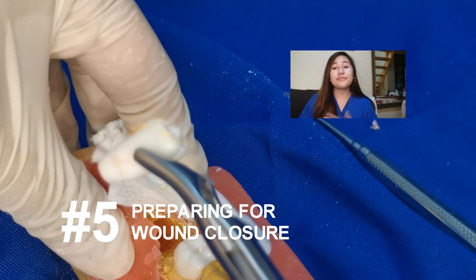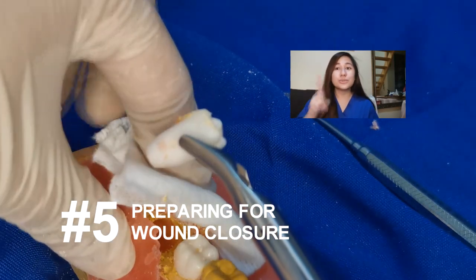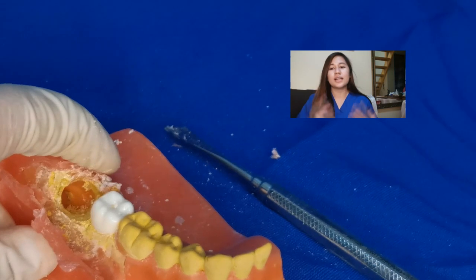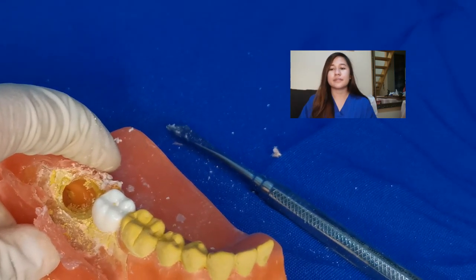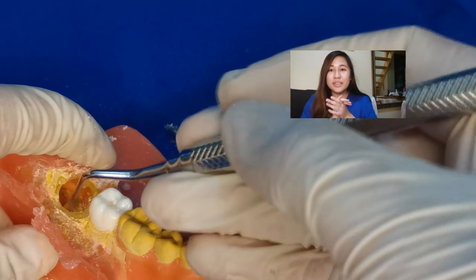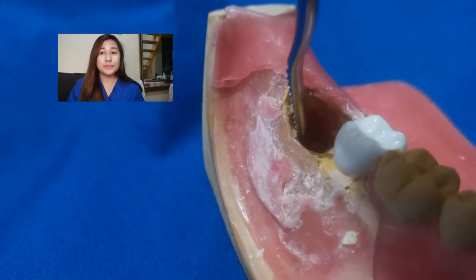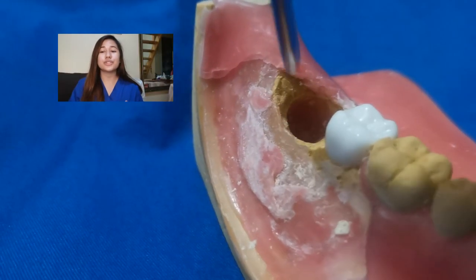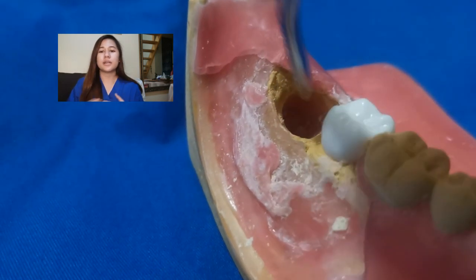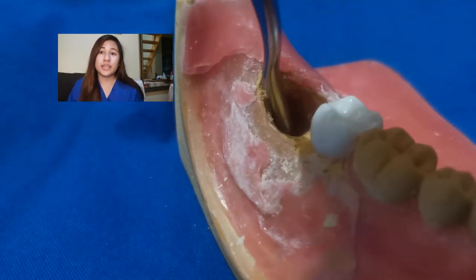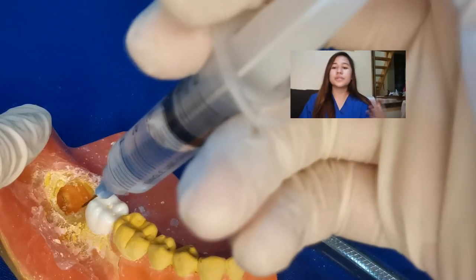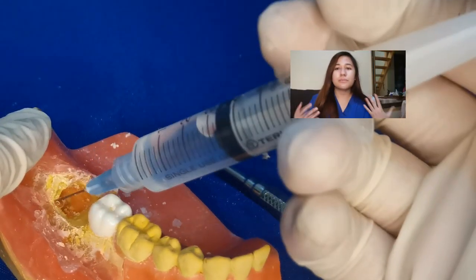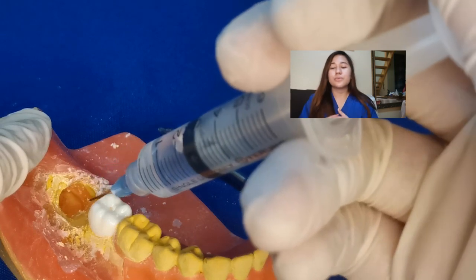Preparing for wound closure: once the tooth has been removed, the socket requires careful care. Gentle curettage of the socket is done. A bone file is used to remove the sharp and rough edges, particularly where the elevator came in contact. Removal of all particulate bone chips and debris from the wound is done through irrigation. Sometimes we place gel foam on the socket to aid and provide hemostasis.